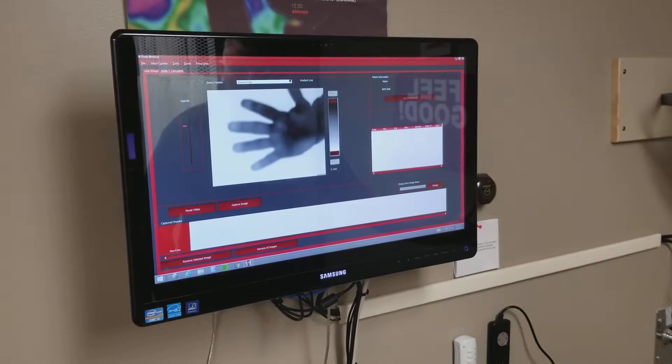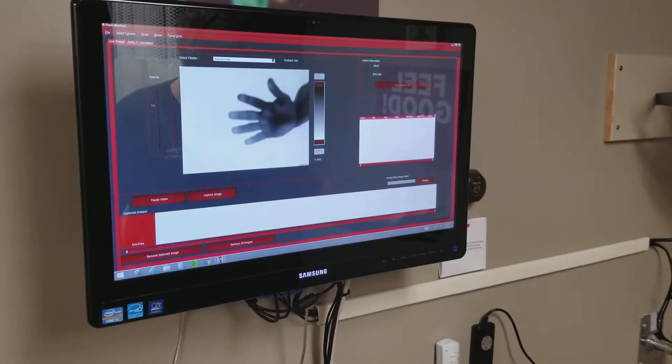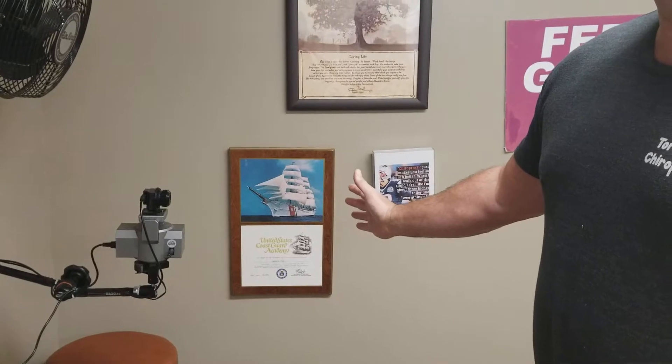If I move my hand closer, it starts to get blurry. About the distance for your breast testing is about 18 inches from the camera — that's about where you want to start. You can actually try it by sitting in front of it to make sure that the breast is properly exposed and focused.